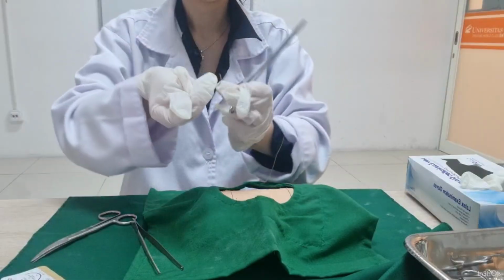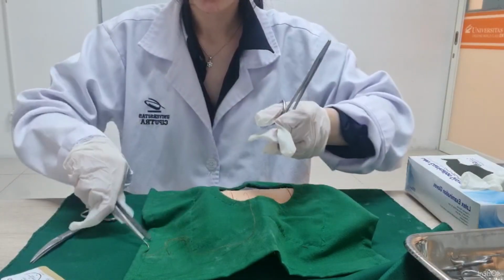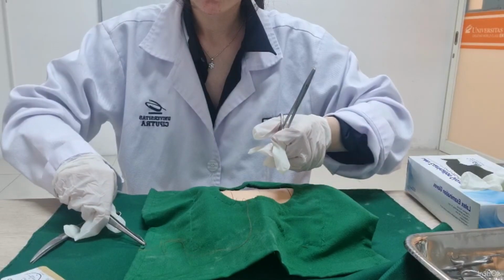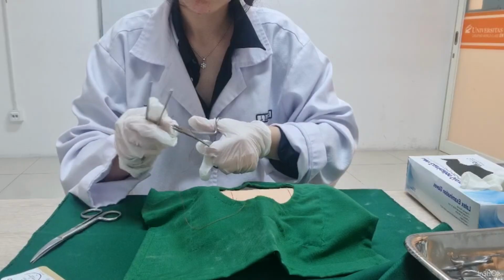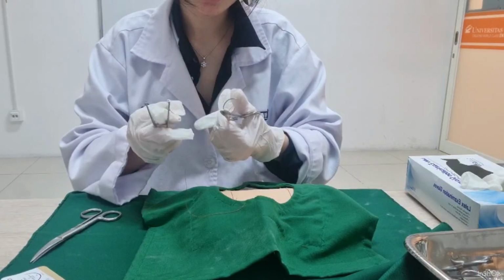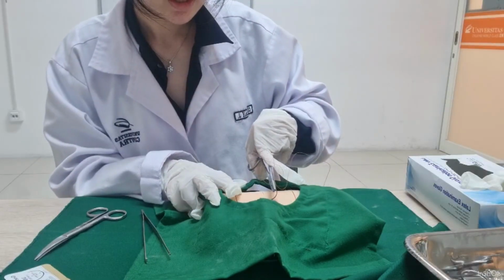So the same thing, I will hold the needle in the distal 1/3 with my needle holder. Okay, and since it's already in position, I will lock the needle now. And I will continue my simple interrupted suture.